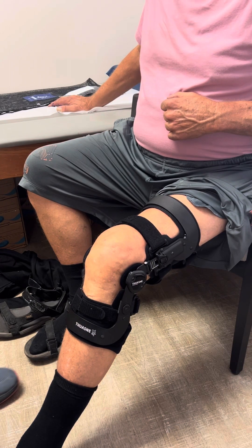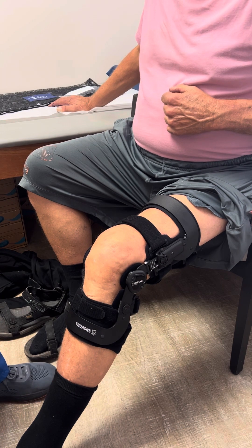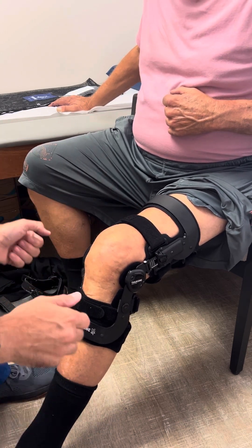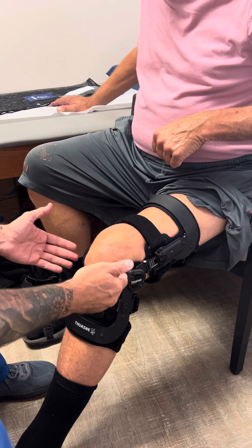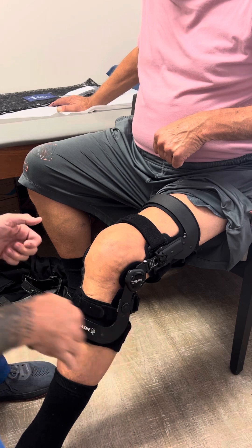We're going to take off and refit this Townsend Rebel Reliever Brace. For most patients I like to leave these two straps done so that the patient doesn't undo them on their own, and I fit it so I can get the hinges aligned right through the midline of the knee joint. The patient just has to sit on their leg and tighten the forward and back straps every time they put it on.